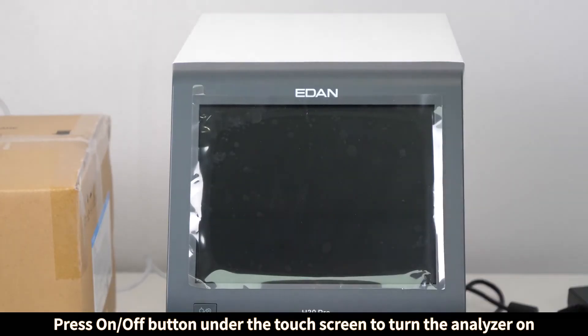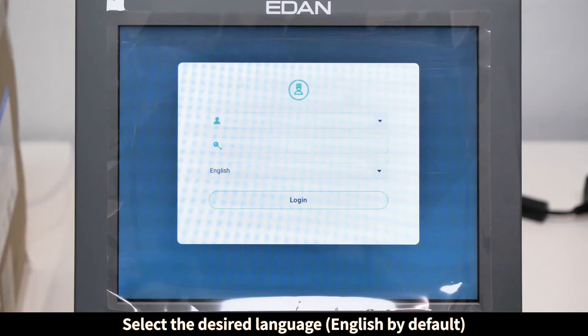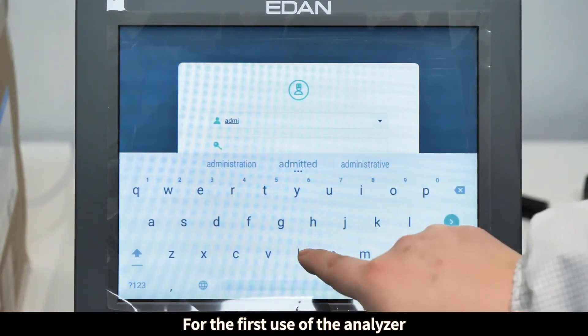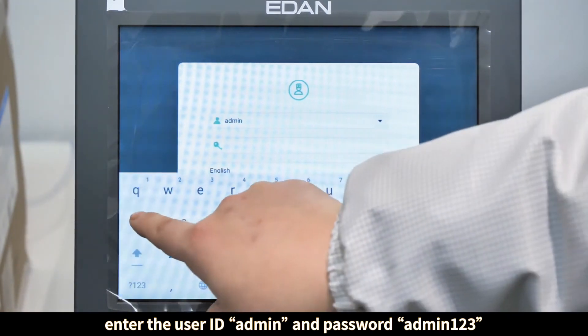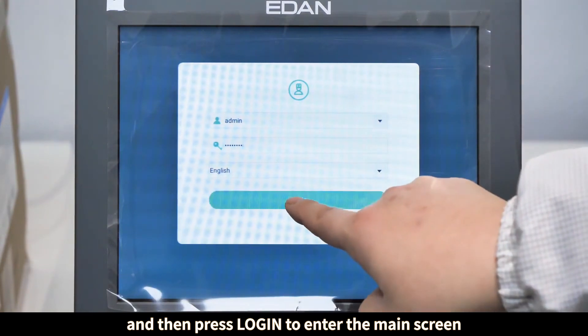Press the on/off button under the touch screen to turn the analyzer on. The system will go into the login screen. For the first use of the analyzer, select the desired language, enter the user ID 'admin' and password 'admin123', then press Login to enter the main screen.